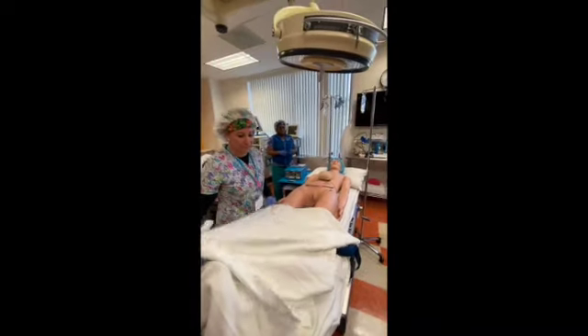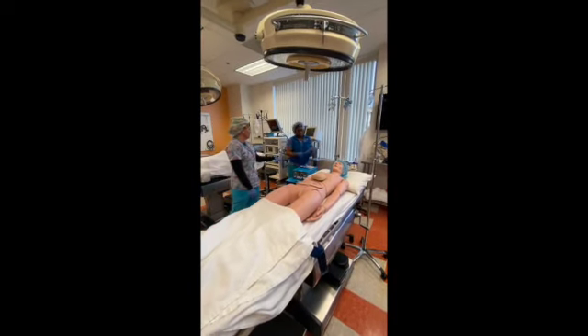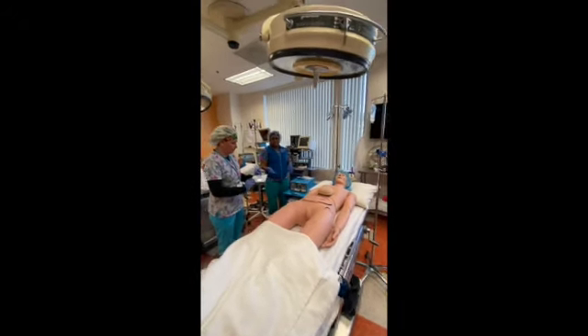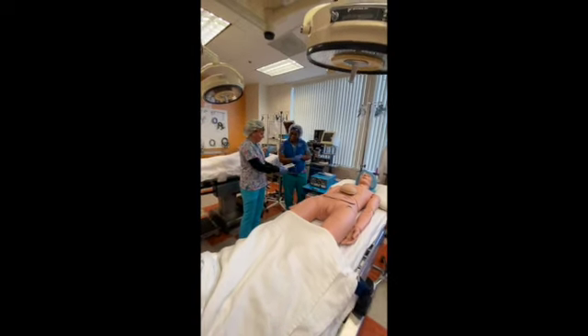Select the appropriate size grounding pad for the patient's skin surface. We've selected the right size. Inspect the package integrity and check the expiration date.